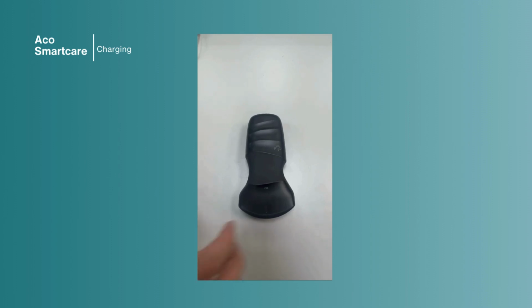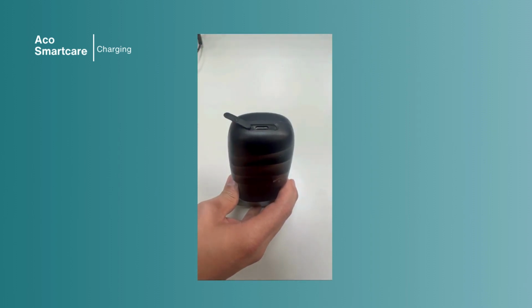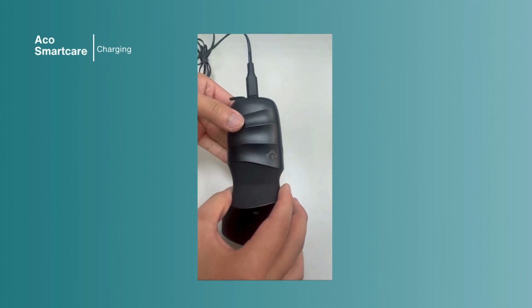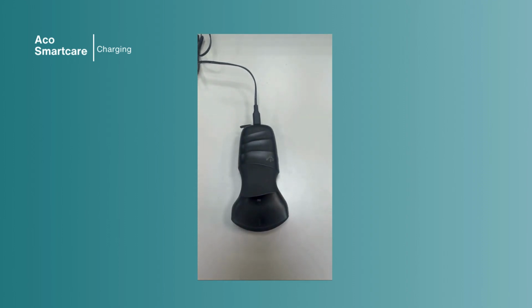To charge the probe, simply open the port cover. Plug in the Type-C charger into the port. The LED white light will start blinking once the probe is charging. We recommend users charge at least 30 minutes for the first time.